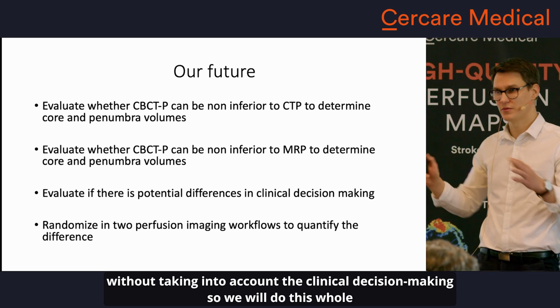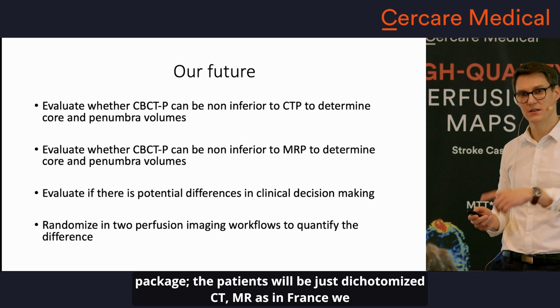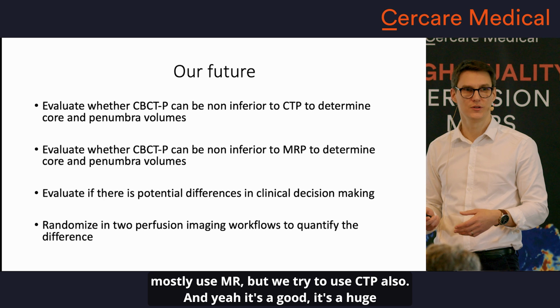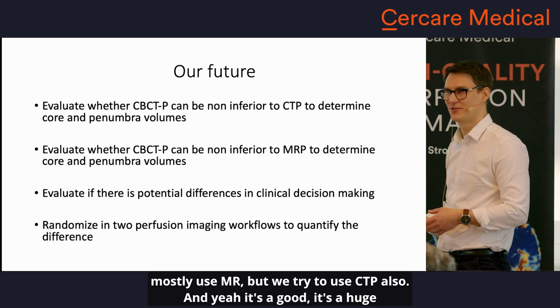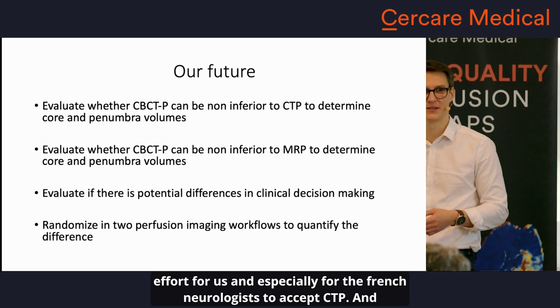So we will do this whole package. The patients will be just dichotomized, CT, MR, as in France we mostly use MR, but we try to use CTP also. Yeah, it's a huge effort for us, and especially for the French neurologists to accept CTP.